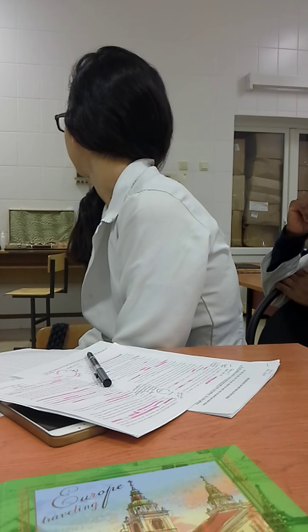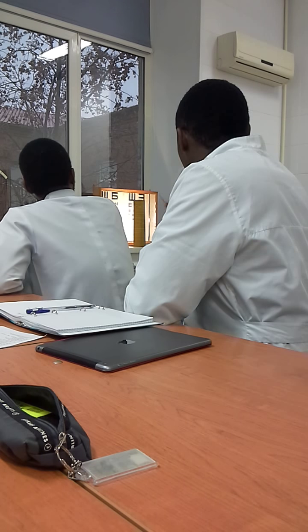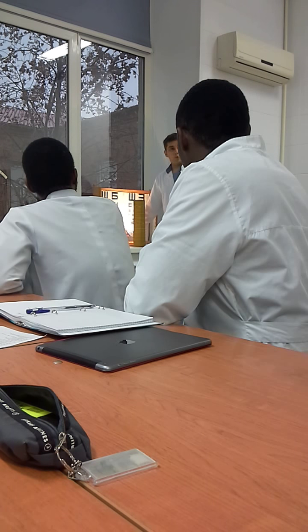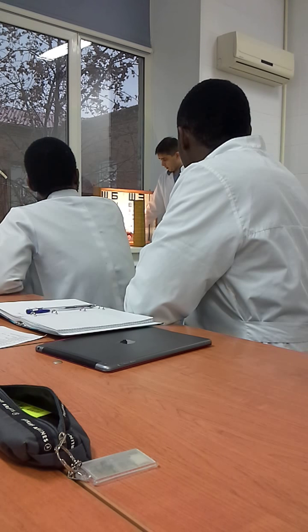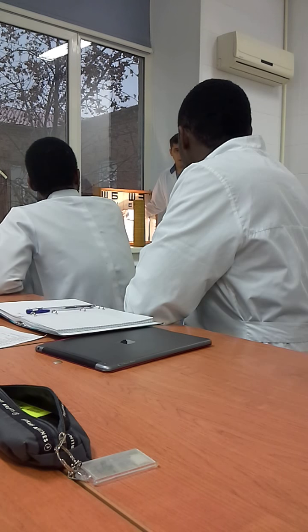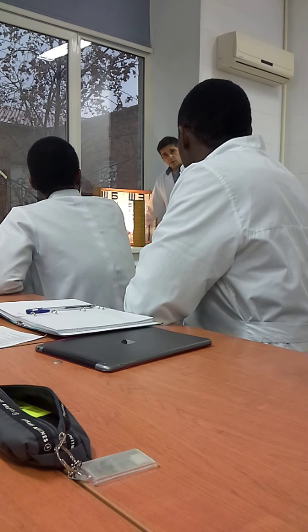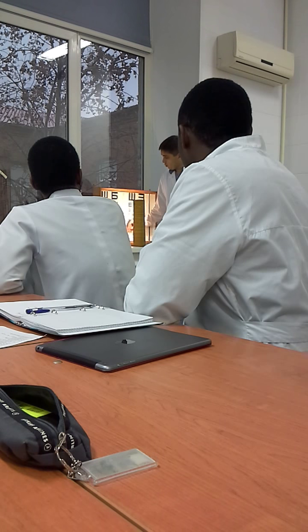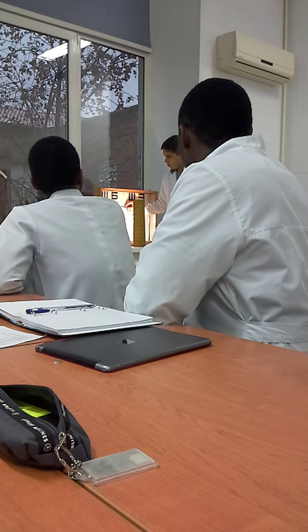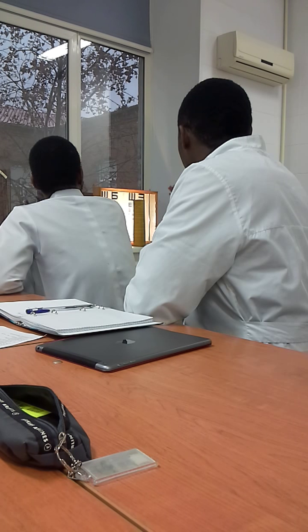We start from the tenth line. If the patient can read the tenth line, we stop — visual acuity of the right eye is 1, and that is all. You understand: if the patient can read small letters, of course he can read everything above. It is not necessary to show all lines. If your patient says no, they can't see that line, or the number of mistakes is too large, you should start from the very beginning and show lines one by one until the patient says no, they can't see the next line.